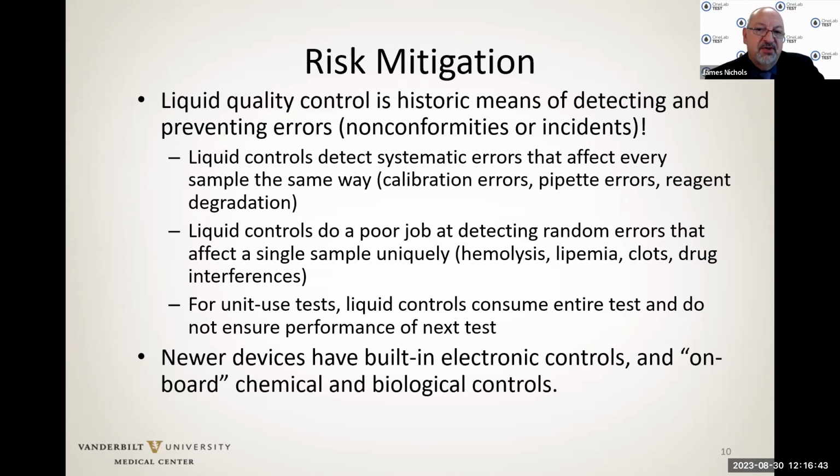But liquid controls do a very poor job at detecting random errors that affect a single sample, very unique from the liquid quality control. Things like hemolysis, lipemia, clots, drug interferences in a single sample. Quality control does a very poor job at detecting those because the quality control is a separate sample.